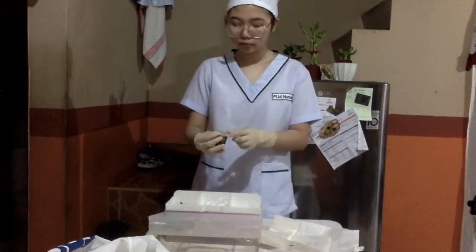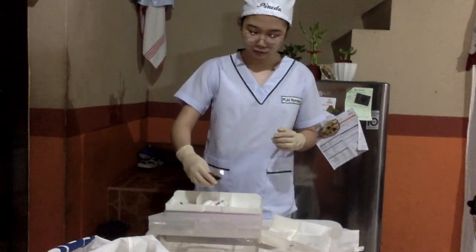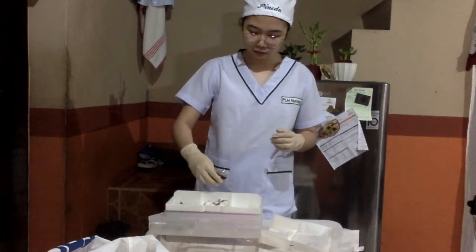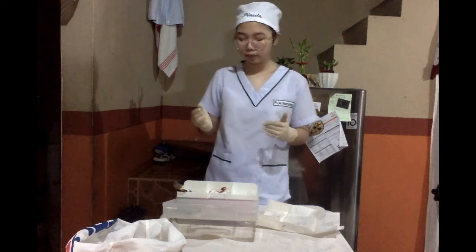I will now pour the iodine solution in the cotton balls. So this prepares the cotton balls for cleaning. The iodine solution is used because it removes the germs from the skin. So I will now separate the cotton balls using forceps for easy manipulation.